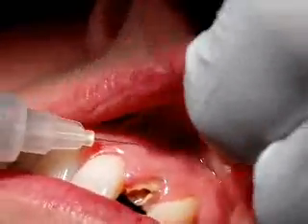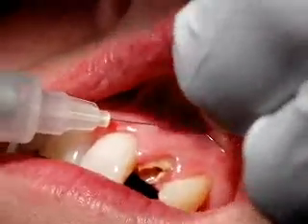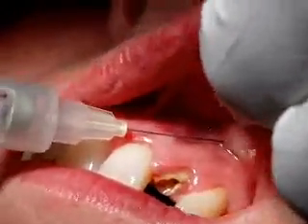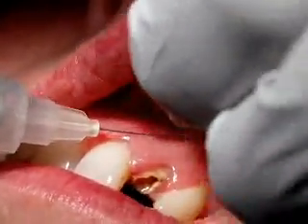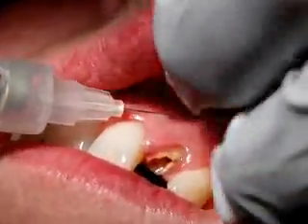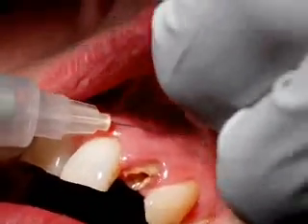Let's see how much time we're doing. Are we feeling anything there? Not anything. So what I'm going to do is probably pop in about two-thirds or three-quarters of this cartridge.